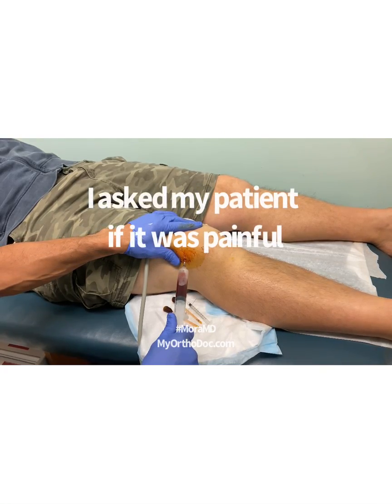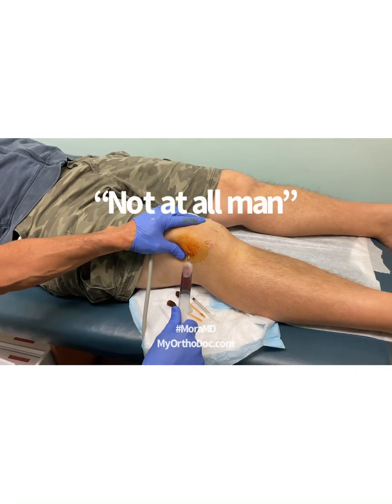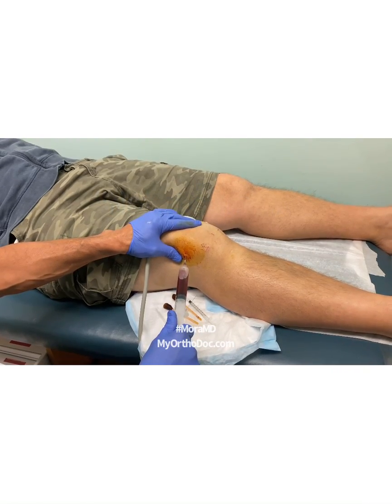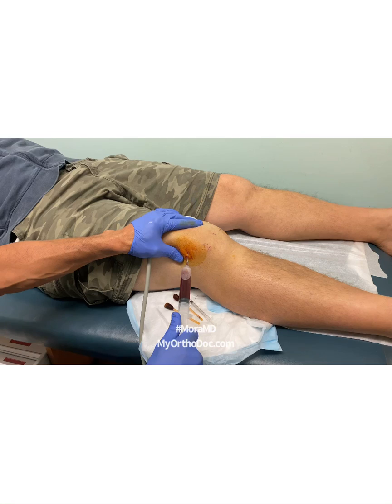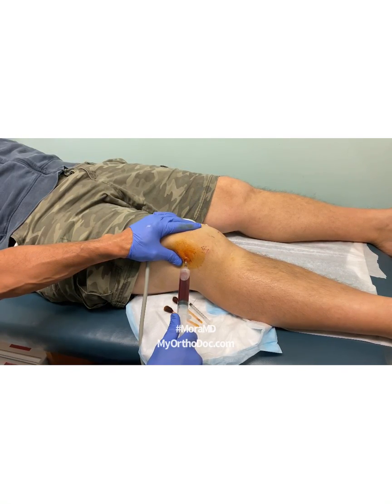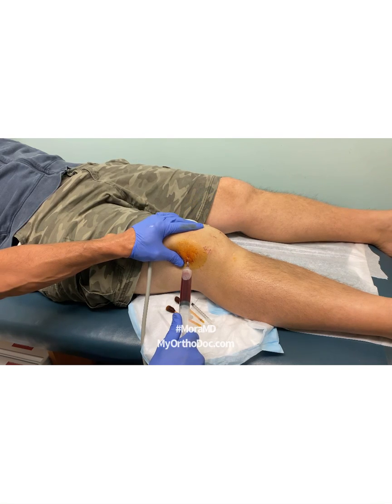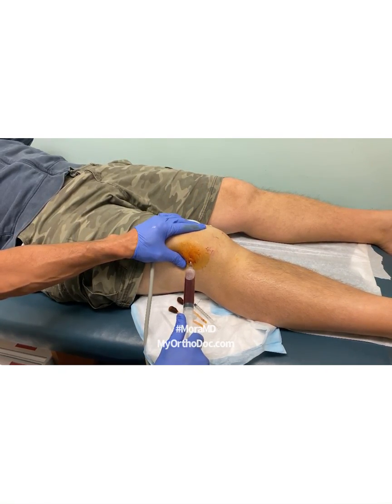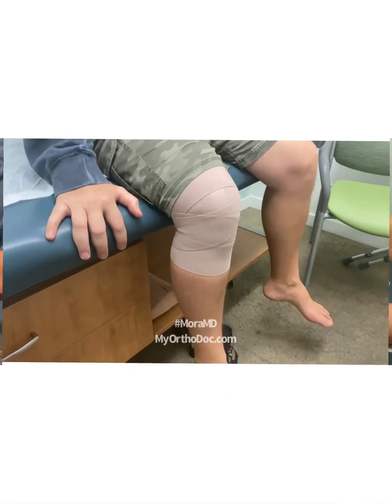Was that very painful? Not at all. And my patient was not paid to say that. This syringe is going to be full — it'll probably take two of these. I'll continue to show folks that when an aspiration is done correctly, it doesn't have to hurt that much.